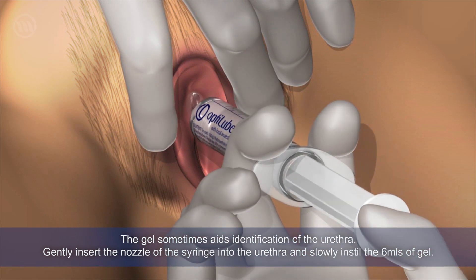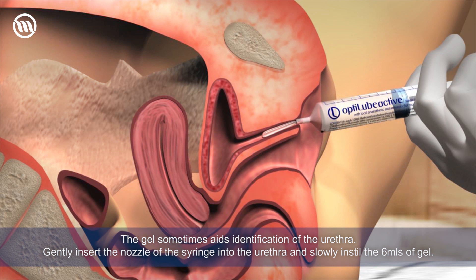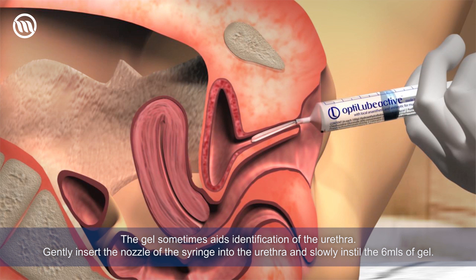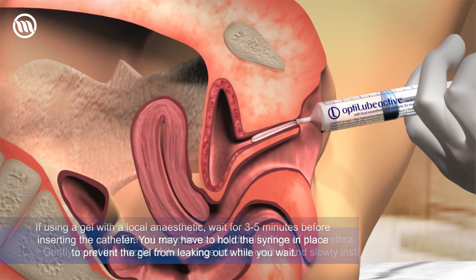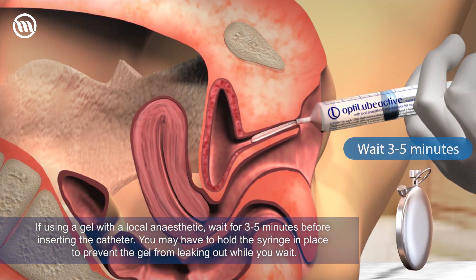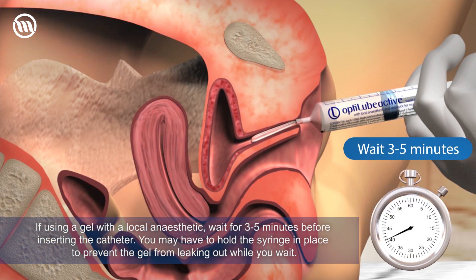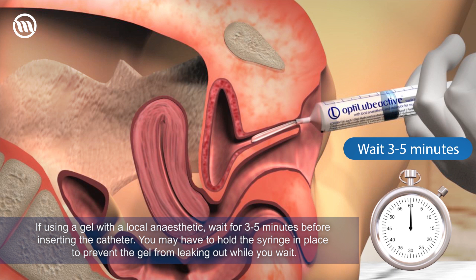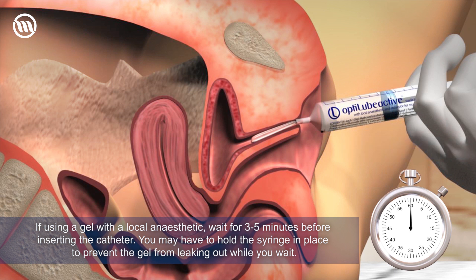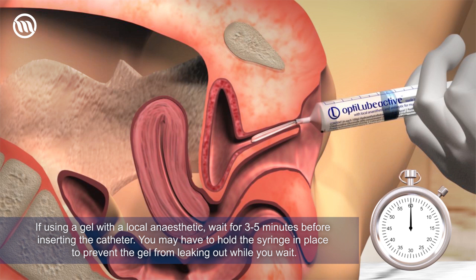The gel sometimes aids identification of the urethra. Gently insert the nozzle of the syringe into the urethra and slowly instill 6 mls of gel. If using a gel with local anaesthetic, wait 3 to 5 minutes before inserting the catheter. You may have to hold the syringe in place to prevent the gel from leaking out while you wait.